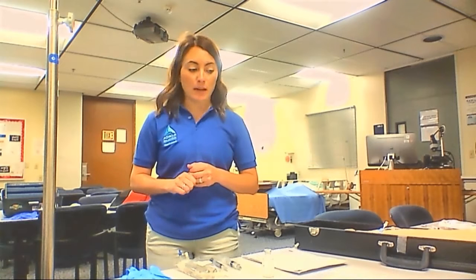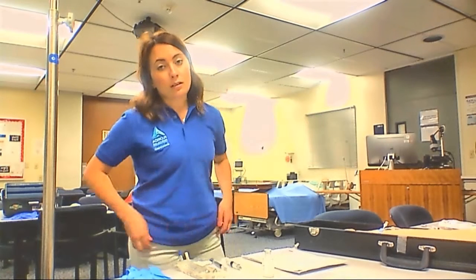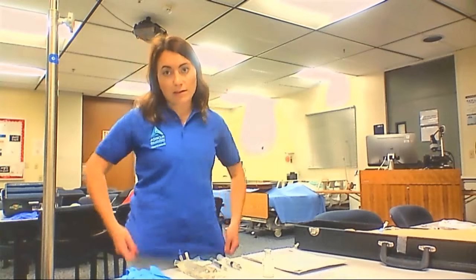I am in Adult Health 1, Section 11, and I'm going to be doing administration of medication via a mini bag. So the first thing I'm going to do is implement my standard protocol. I want to make sure that the doctor's orders match the MAR and that I am working with the correct patient. So I can verify the patient by two identifications. So I'm going to use the patient's name and the patient's date of birth.